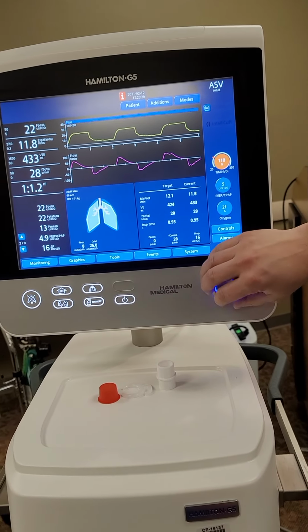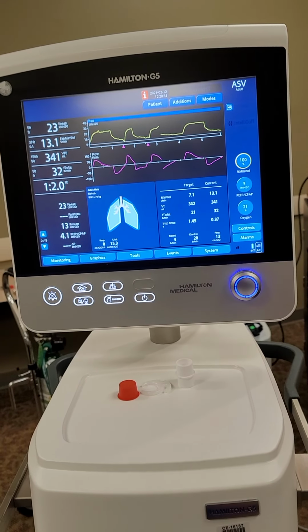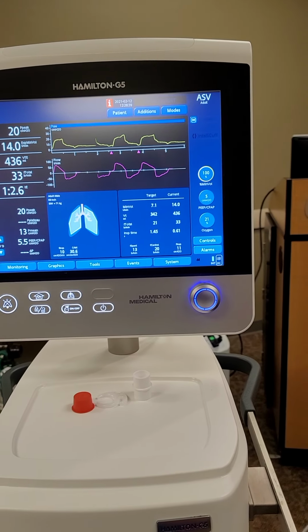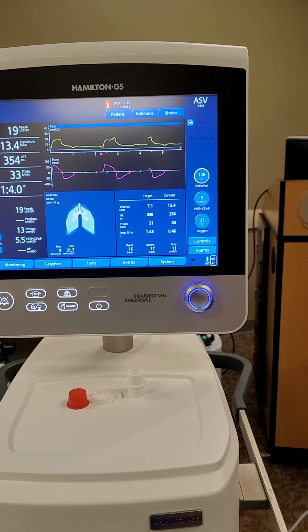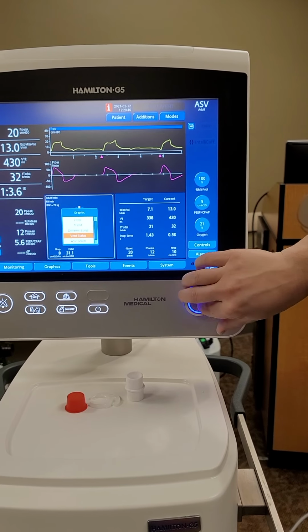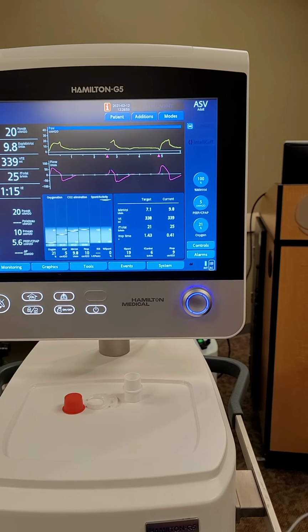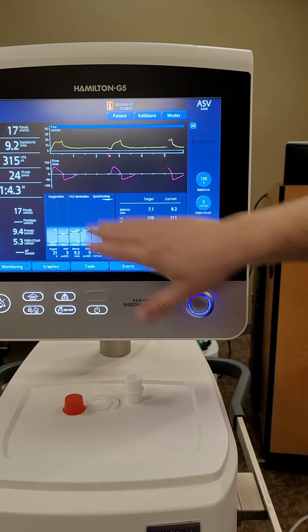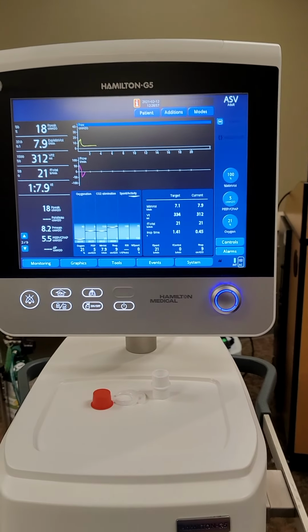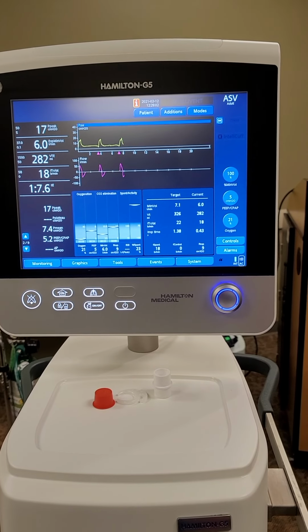If I'm down to like in this 100% range right now, nice. And my patient is doing all spontaneous breaths. Yes. Like this, you're going to start seeing this come down. You can actually switch this lung out and see when all these things come down here, if your timer's up, to see if they're in minimal settings and how long they've been in them. Gotcha. So as this gets down here, we should start seeing that happen.